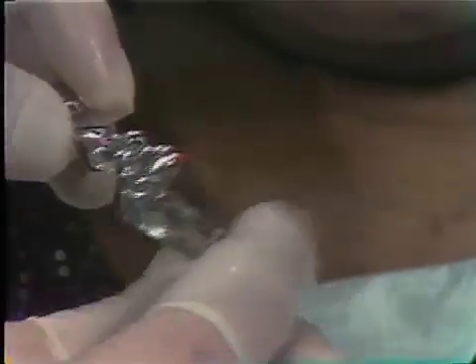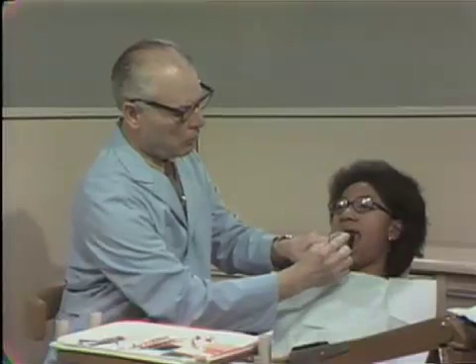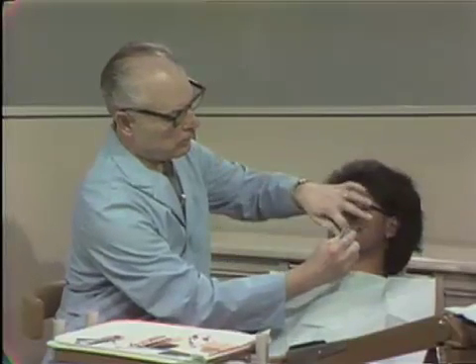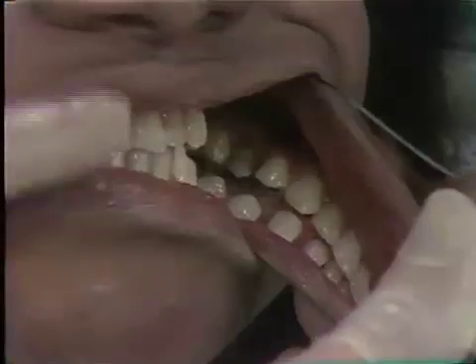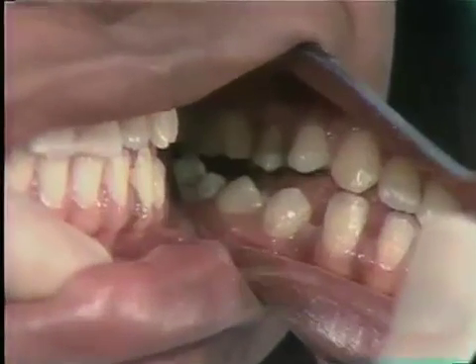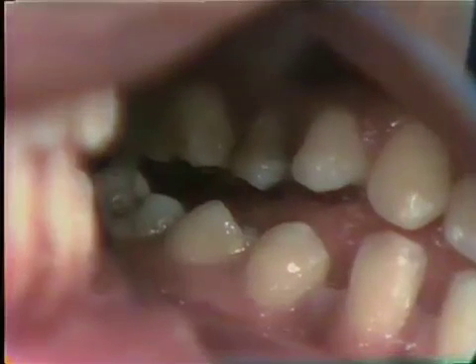Of significance here inter-orally is the fact that the teeth have been intruded, which is the common sequelae of this type of appliance. Notice the space between the bicuspids and the molars.